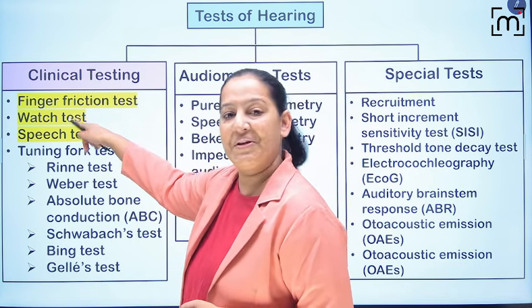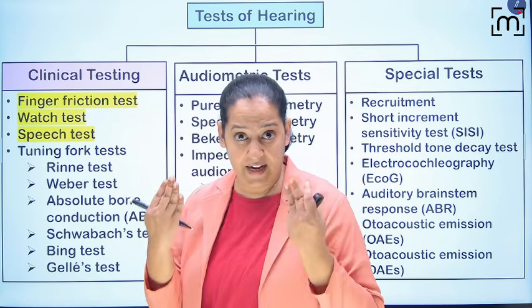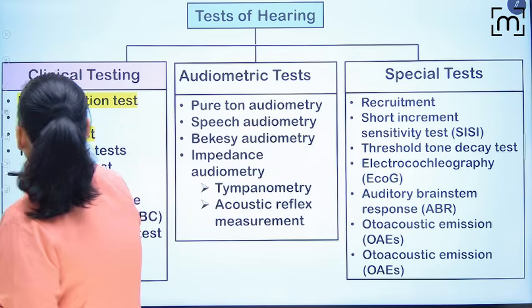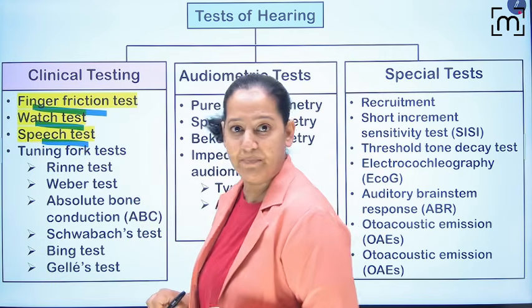In the clinical tests, these three were done yesterday. Quickly, in one slide, we will revise it. What are the three tests? Say the names. The three tests are, you can see, the finger friction test, the watch test, and the speech test.